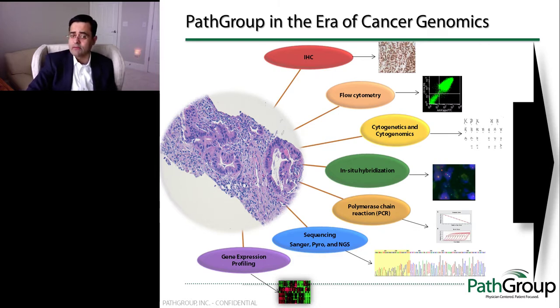This is an invasive colon cancer. And this is an H&E slide and an example of what a pathologist would see under the microscope. And, based on a decision that renders this diagnosis, pathologists might utilize immunohistochemistry to make sure that it's of colon origin, and then use other technologies depending on if this is a colon cancer initially at diagnosis.